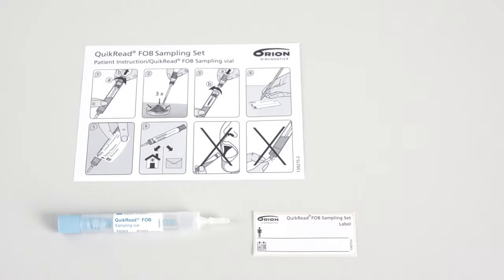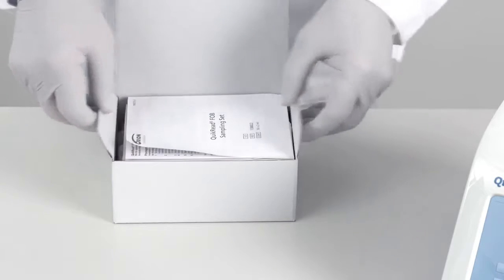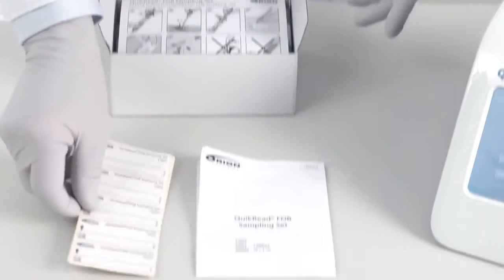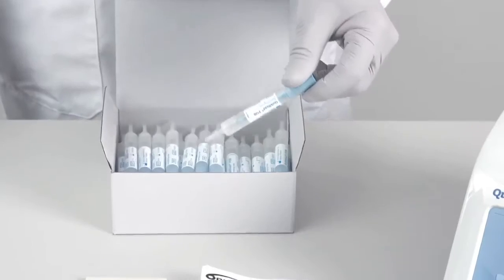QuikRead FOB sampling vials are handy and hygienic vials which control the volume of the sample. The vials allow sampling at home. The QuikRead FOB sampling set kit contains instructions for use, patient labels, and patient instruction sheets and sampling vials.